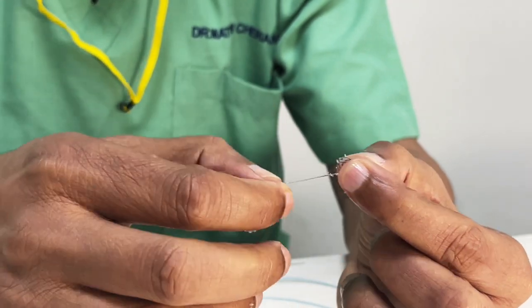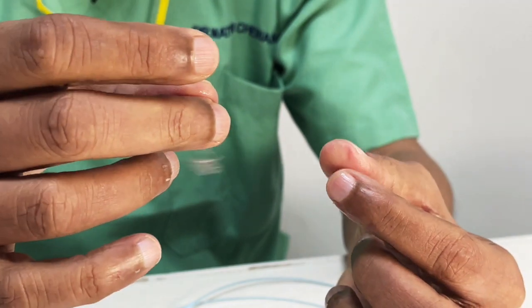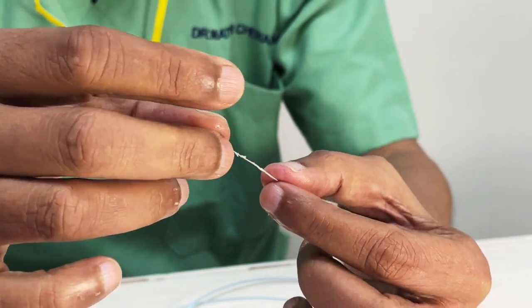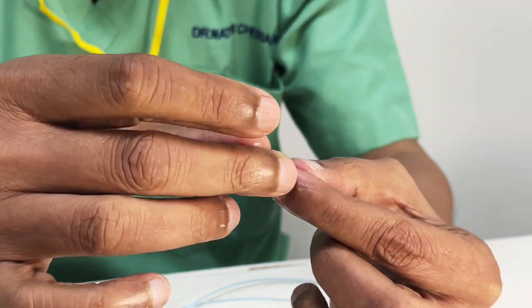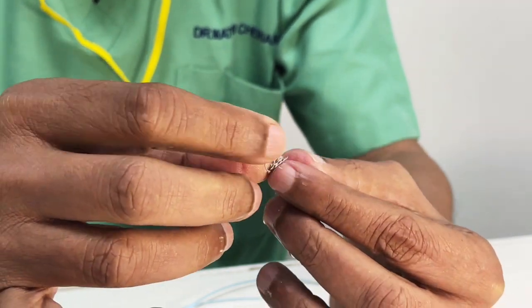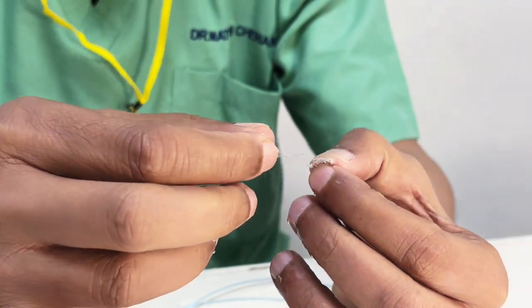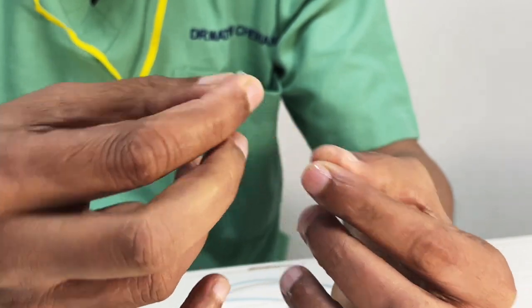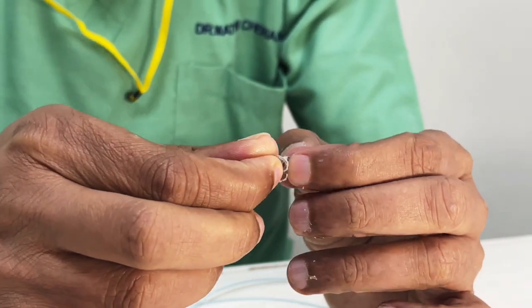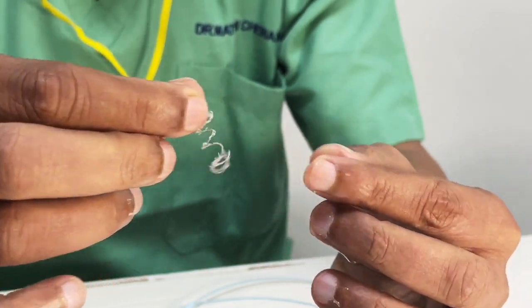Okay, so these are also made of platinum with the Dacron mesh. Having said that, even though we say they are permanent, we have seen sometimes coils get endothelialized and a fresh channel opens up. So nothing is permanent. In our experience, the most permanent thing has been liquid embolic agents, but this definitely works like a large vessel ligature. So because they work like a large vessel ligature, remember, if there are distal collateral pathways, they will open up, right?